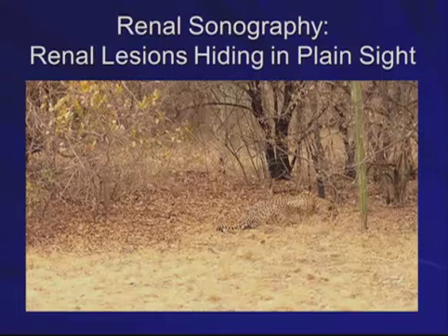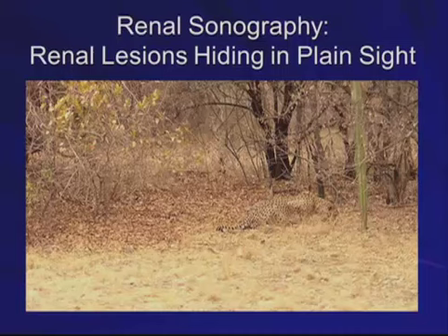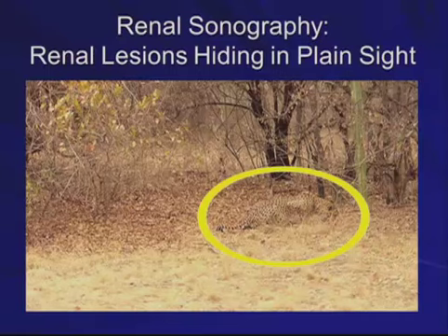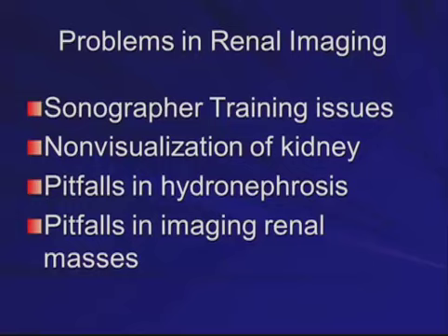Well, renal sonography is a very unusual topic in that although for ultrasound it's very easy to see the kidneys, in fact, renal lesions are commonly missed because they're very difficult to spot. And so, like this cheetah, it's very important that an imager, as they're looking at the kidneys, looks at them very, very carefully in order not to miss lesions.